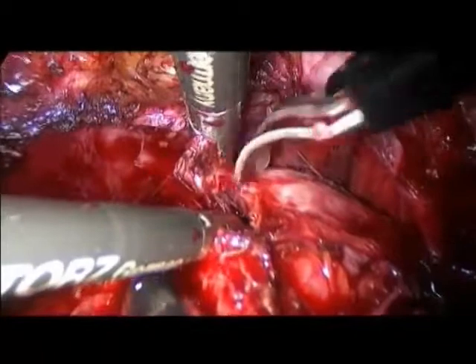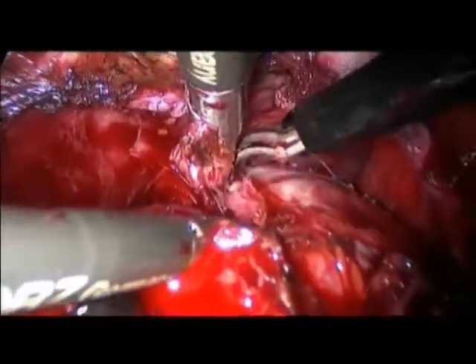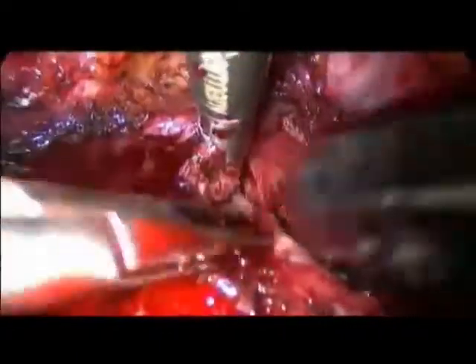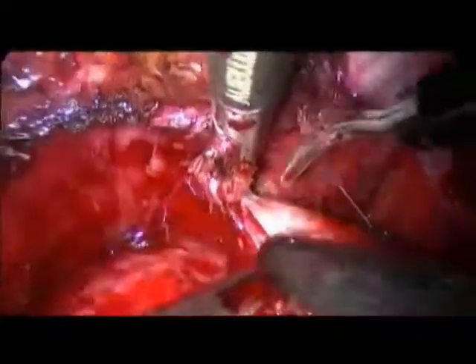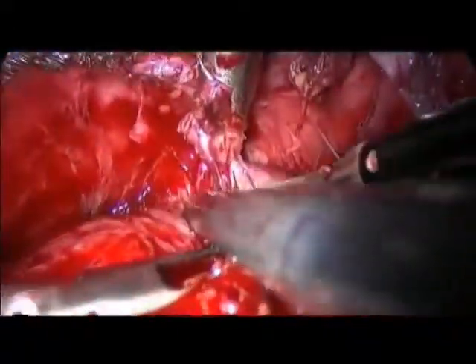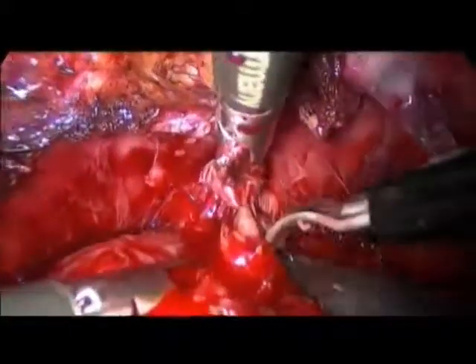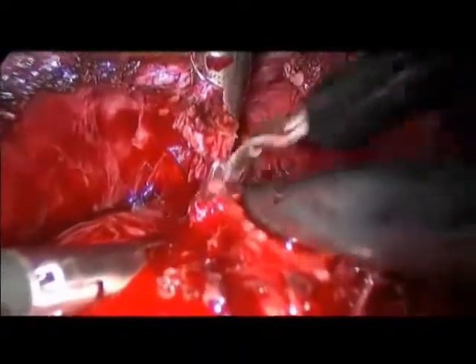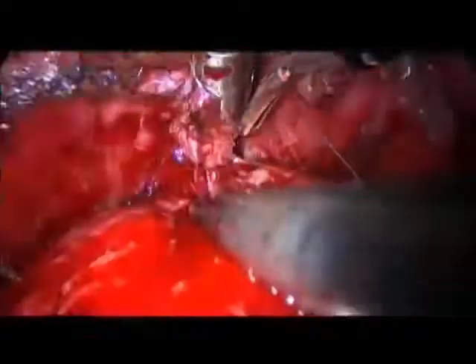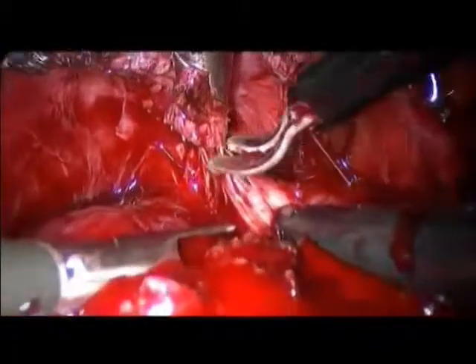After, we are now ending at the tip of the forceps, as you can see. The drawback of this approach is, of course, that the apex is naked, and mainly naked, not here, where it is still covered by the prostatic fascia, but naked here in the surrounding structures of the urethra. The apex is not open, but it is naked. That means that if you have tumor at this level, you have tumor in contact.